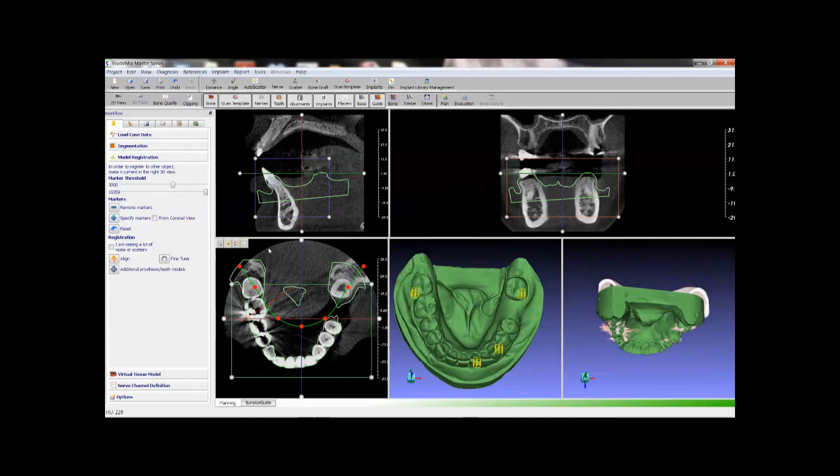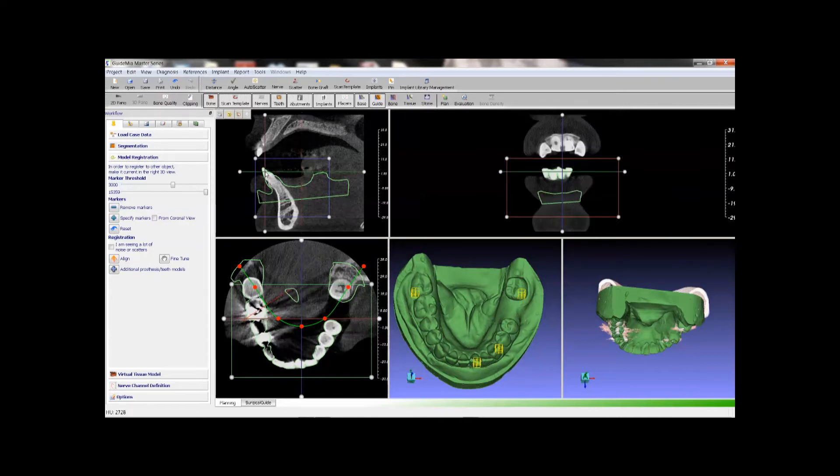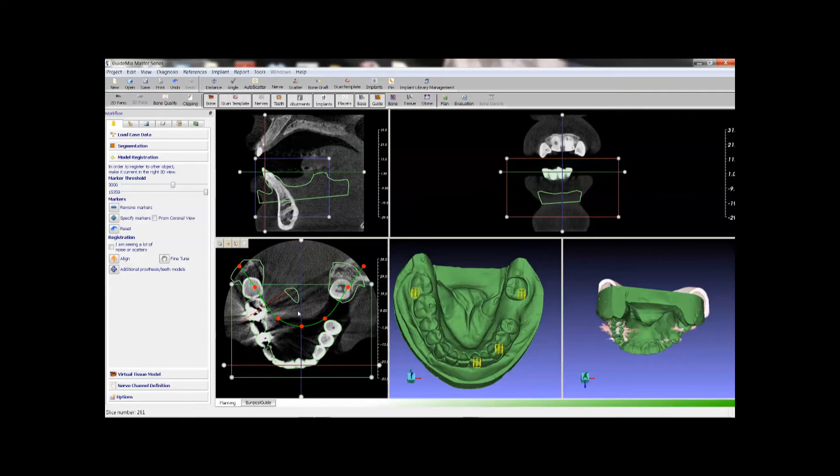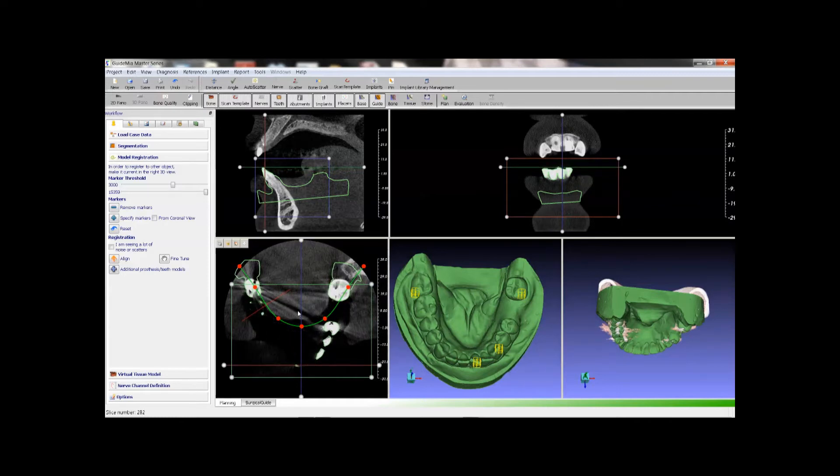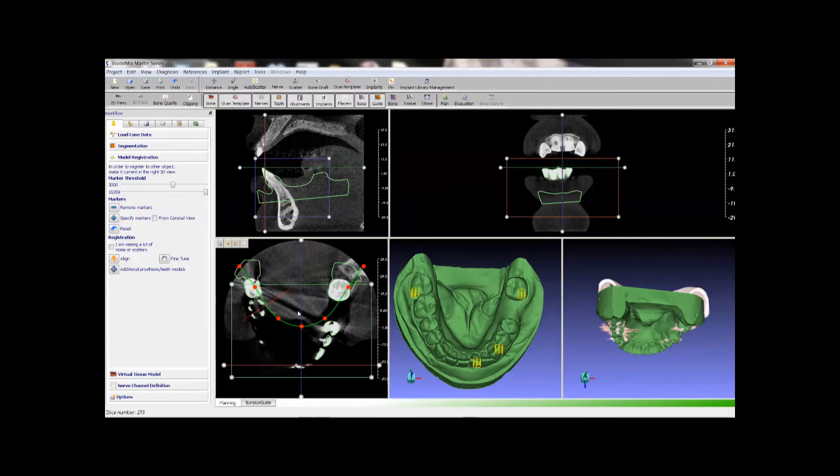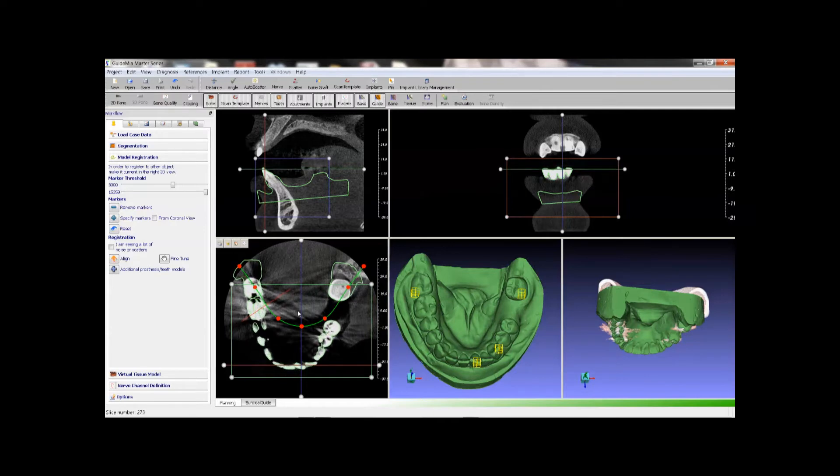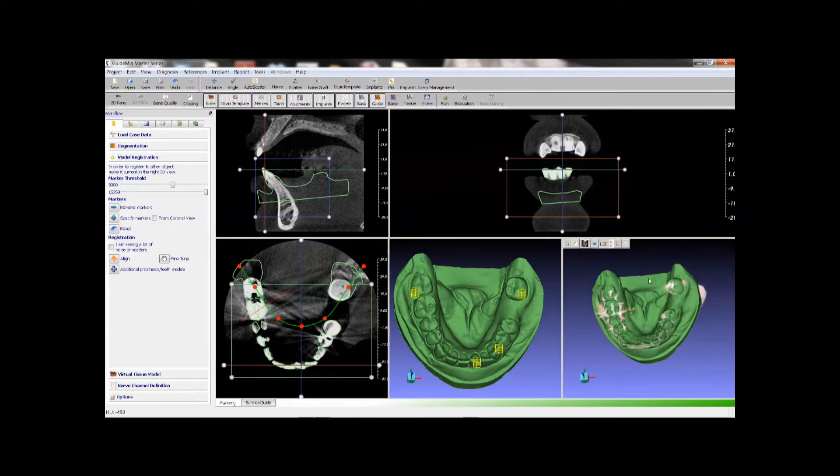We can inspect the results with the graphical views. We use mouse wheel to scroll through the slices and check how well the green curves follow the tooth contour. You can notice that the result is pretty good for this case. Check the 3D assembly view too.